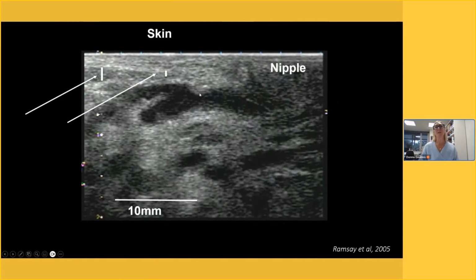Again, this is another mother, and you can see her milk ducts are branching very quickly. Again, a narrower main milk duct to the other milk ducts that are draining into that. Lots of glandular tissue here behind the areola. Again, very superficial under the skin here, a millimeter or two. On average, it is about 4 millimeters if we measure it, so there is some variation between mothers.